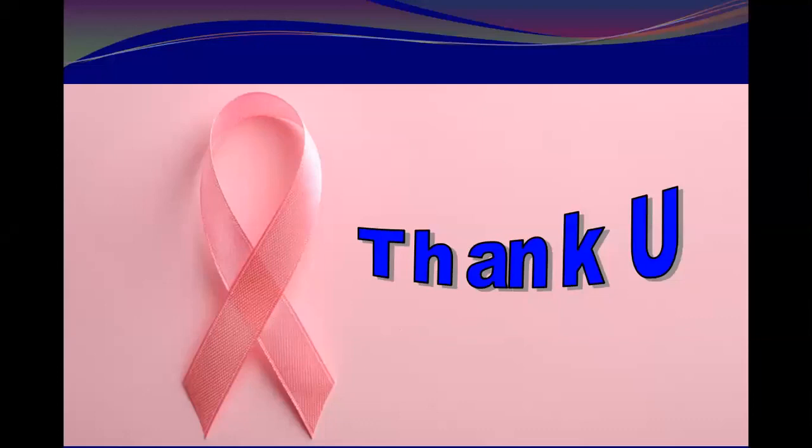Thank you. In the section on annotation, you said that we have 3 zones, zone 1, 2, and 3. Yes. The question is, is there any demarcation between these zones, or is it just suggestive? No, there is no demarcation. It just depends on whether it is a small or large breast. In front of you, you can just divide the breast roughly into 3 equal parts from the periphery toward the nipple, and even the nipple area is not included.